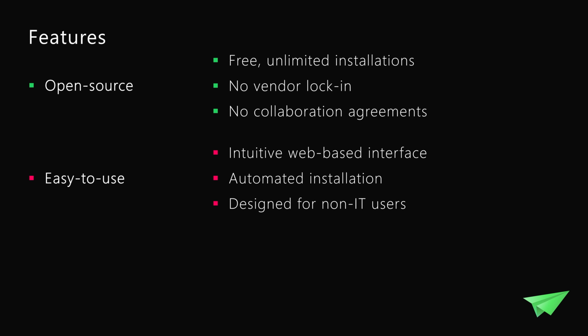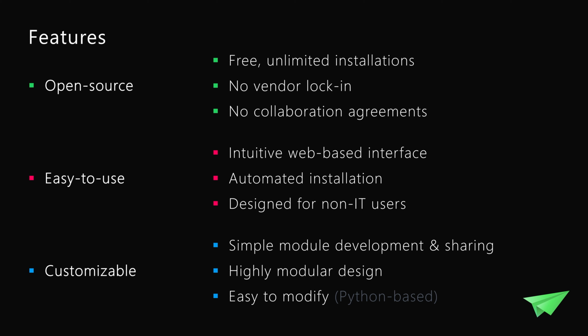The installation is fully automated. And it really has been designed for non-IT users, meaning that you don't need a degree in computer science to use it. And the last point, it's customizable. It's very easy to integrate algorithms as processing modules, and it's very easy to share these modules. But also Mercure itself can be customized. It has a very modular architecture, and it's mostly written in Python, so it's pretty easy to modify it.